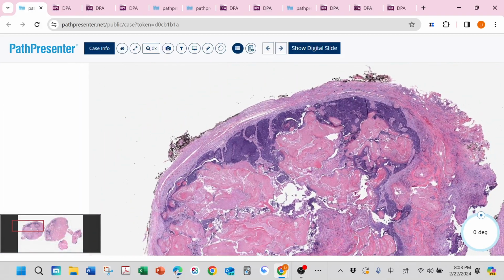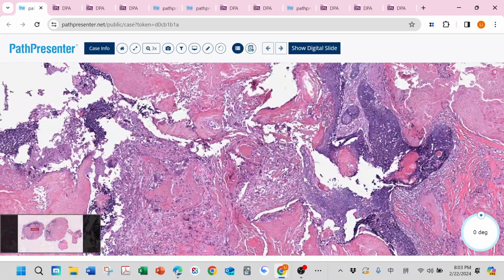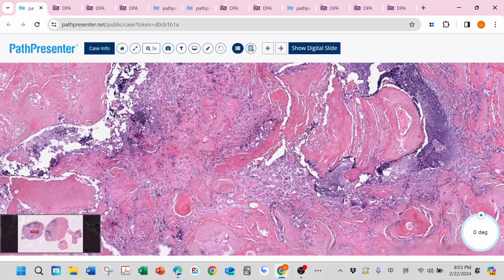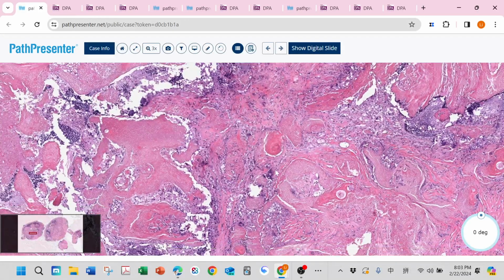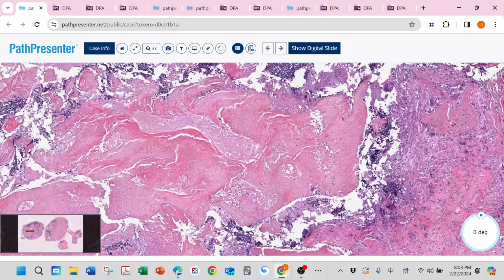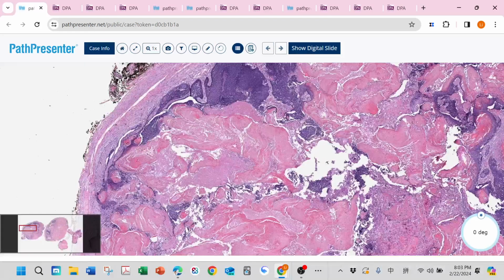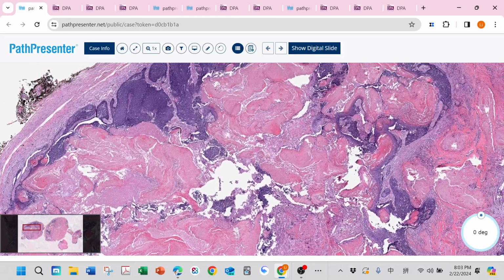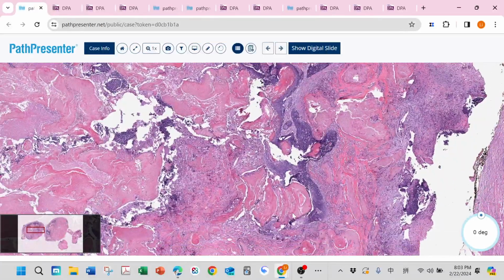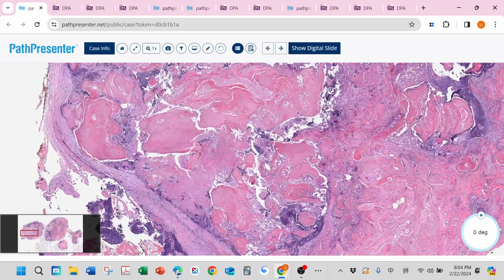Sometimes you may also see some stroma, including, let's try to find it, multinuclear giant cell, hyaline stroma, and even bone metaplasia. So combine these features: matrix primitive cell, ghost cell, sometimes different kinds of stroma, including multinuclear giant cell, bone, hyaline stroma. That one is really good for pilomatricoma, which is a benign entity.